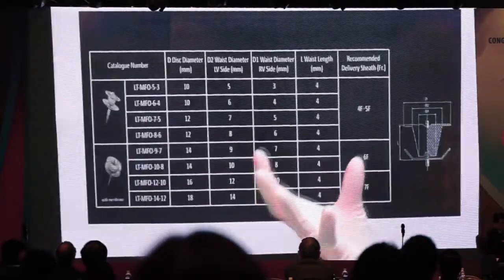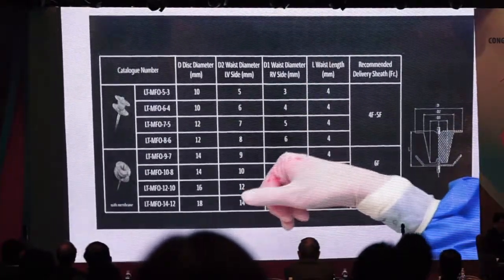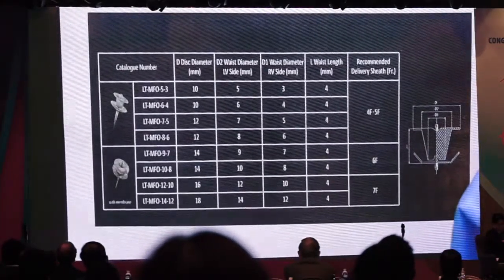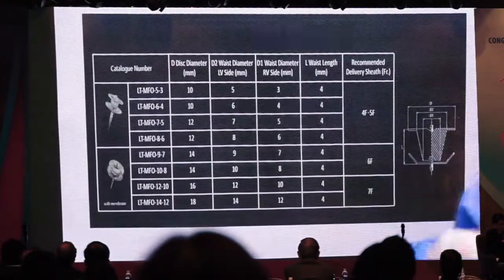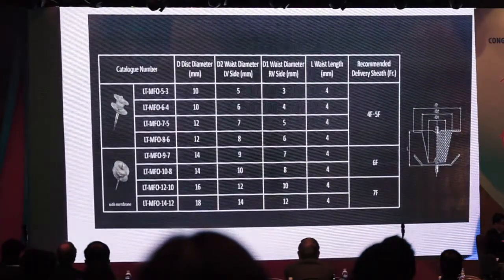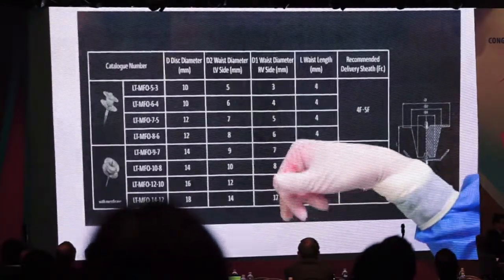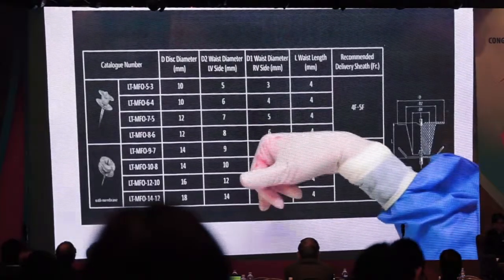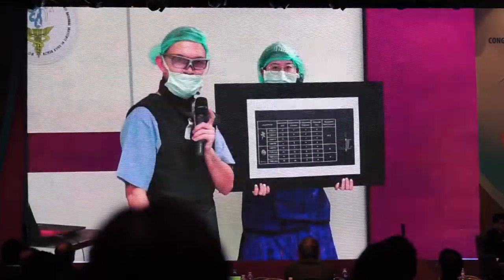Okay, can we see the angio through the machine? Yes, because it's not running. Okay, so we show the pictures of that. This is the angiogram after. So, is there any idea coming further in terms of device selection, feasibility, or whatever, that you think the angiogram is giving any further information or not?